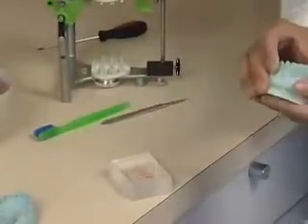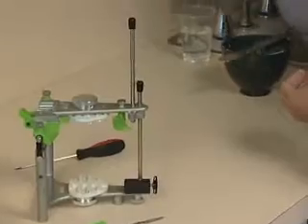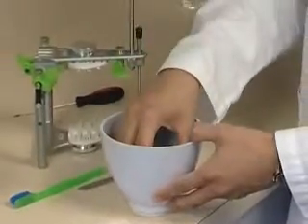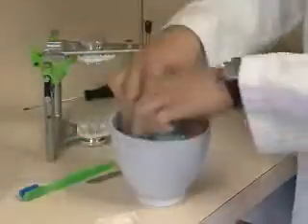Put the base of the upper model in some water and let it be soaking up some water so that when he adds the plaster to it, you'll have a good firm union. If your model was dry, it would take too much of the water out of the mounting plaster and you'd have a weak union. So you want the base of your models wet when you mount your models. Just put it in there and let it soak.